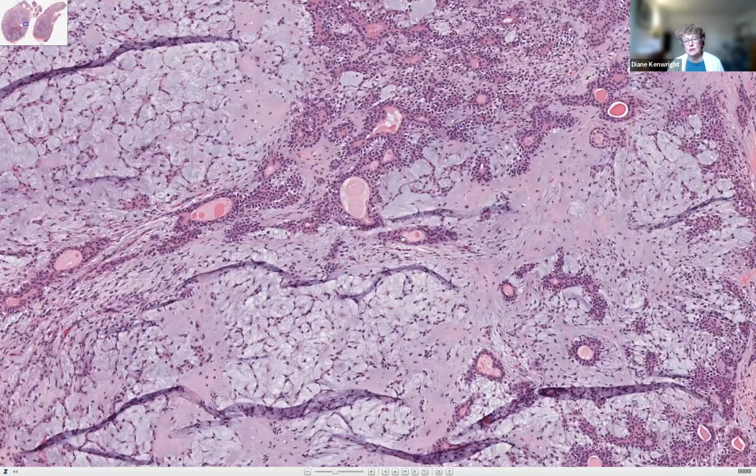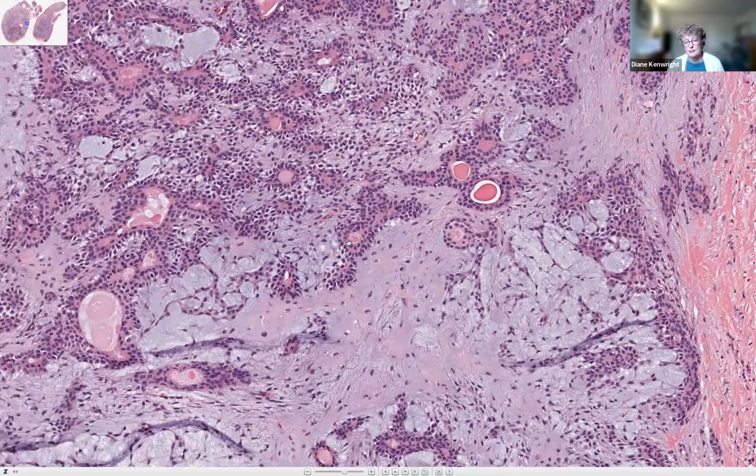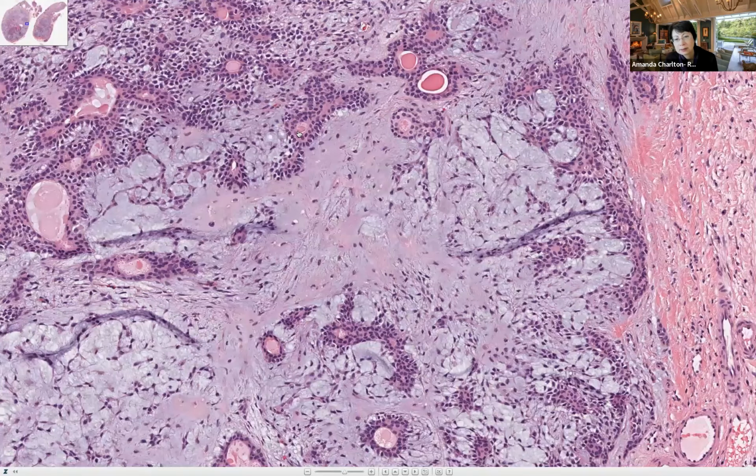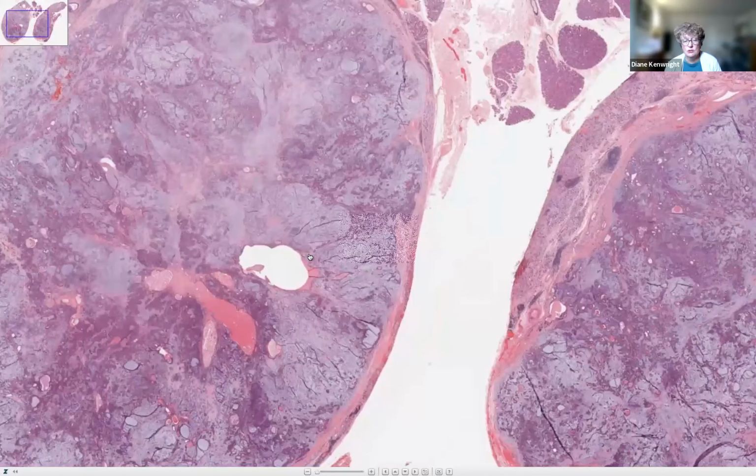And they've always got two quite easily identifiable cell layers, the epithelial and the myoepithelial cells. Which way around do they go? Which is the one on the inside of the lumen? The epithelial cells. Myoepithelial cells are on the outside. And then can we compare to a normal duct? Let's see if we can compare it to a normal duct, because we do have normal here.